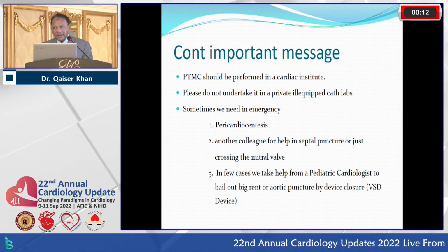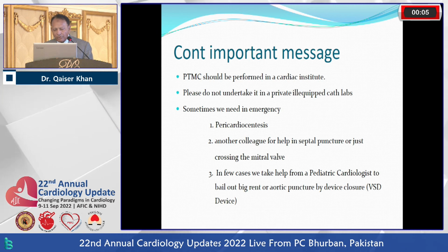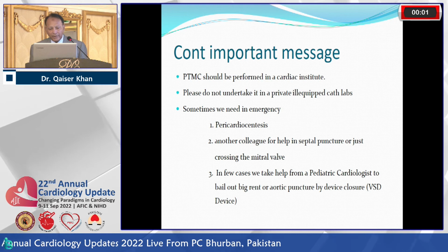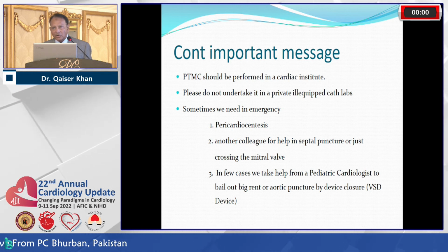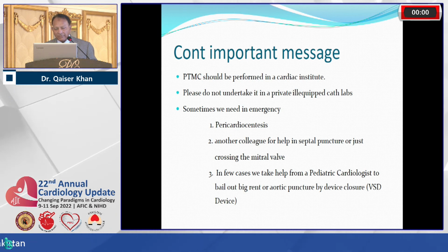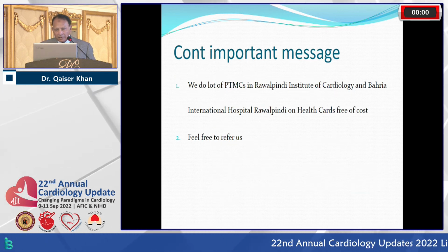In AFIC and RIC both, we have been involving and taking help, in a few cases, maybe two or three, of pediatric cardiologists to bail out a big rent or aortic puncture, and they help us in device closure, VSD closure, and the patient was saved. So this is the benefit of doing the procedure in a well-equipped cardiac center, not in a private lab.